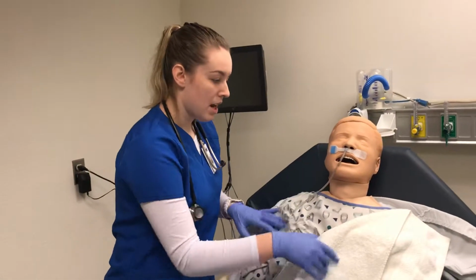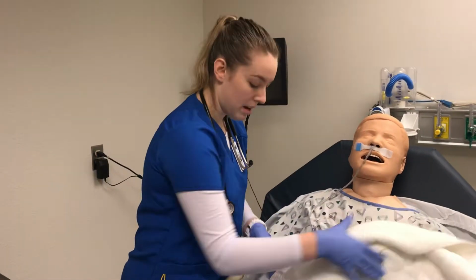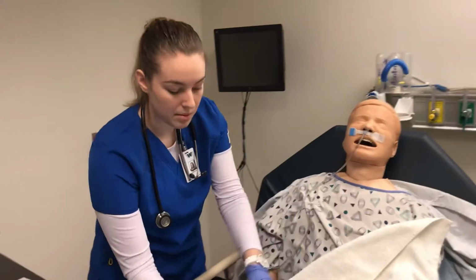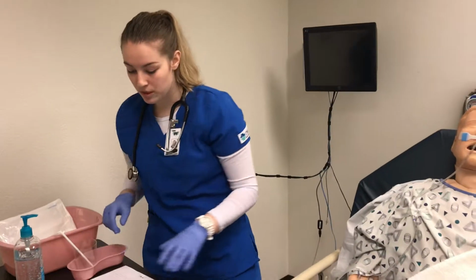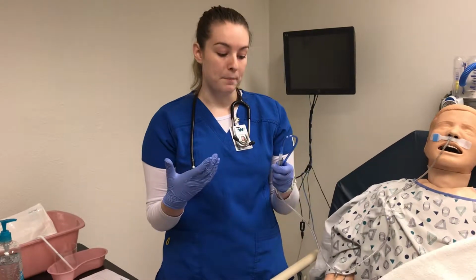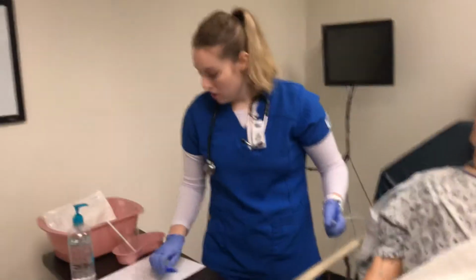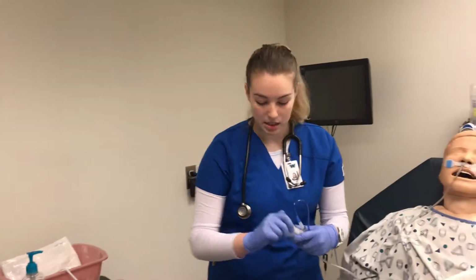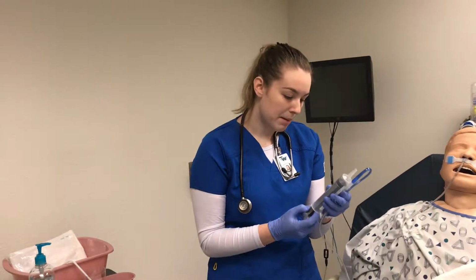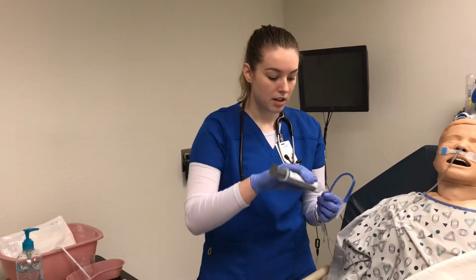Okay, Shirley, are you feeling okay? Yes? Okay. So now I'm just going to aspirate and get some stomach contents to test the pH. And I should have said before that I would make sure that this is looped so no fluid could come back out the tube, which it was already looped. I had done that. So I'm going to take my syringe and I'm going to aspirate 10 milliliters of air. And then I can take this off.